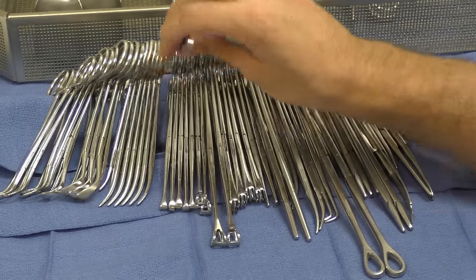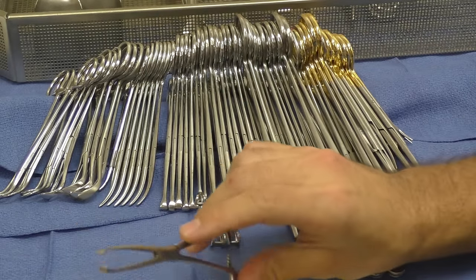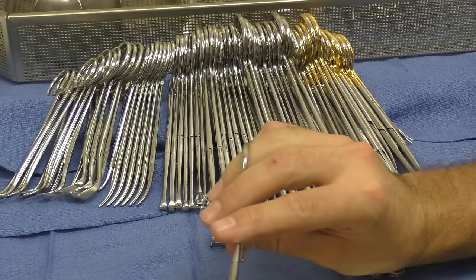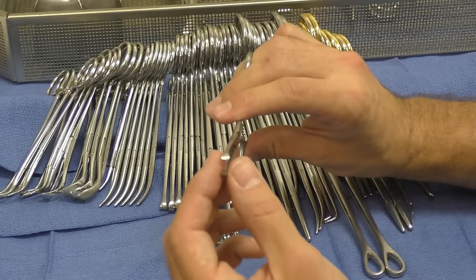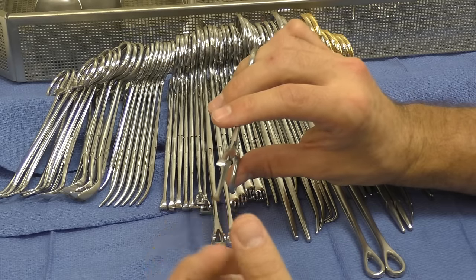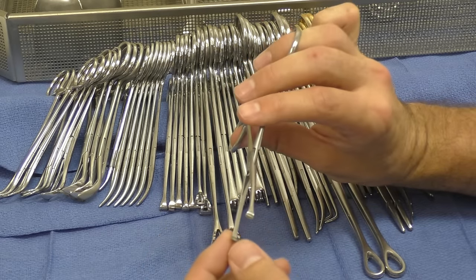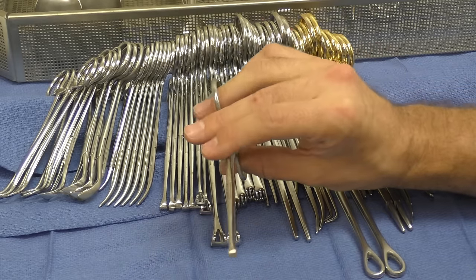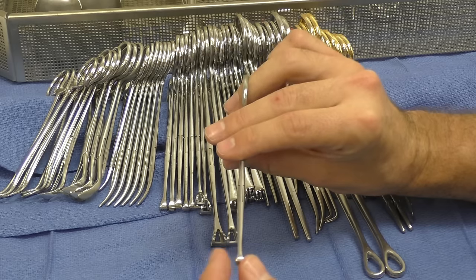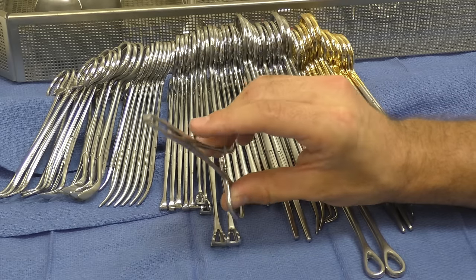Next up, we have the Allis forceps, or the Allis clamp. There is an Allis-Adair clamp as well. The Adair clamp is just slightly wider. The teeth are slightly wider, so instead of maybe 4 and 5 teeth, it's like 7 and 8 teeth or something like that. Usually you'll see those in a GYN set.